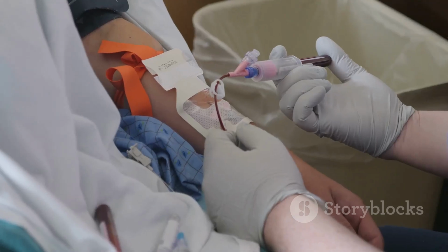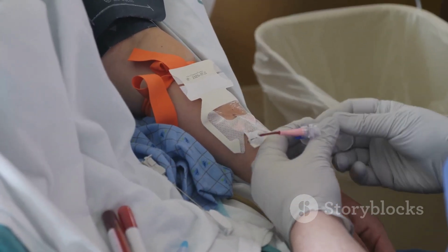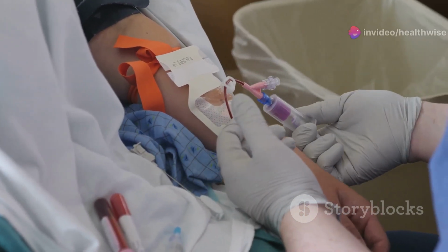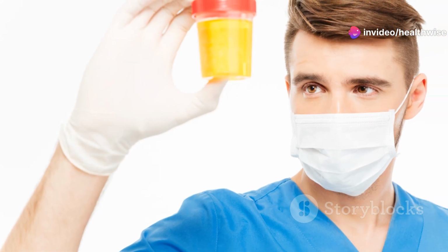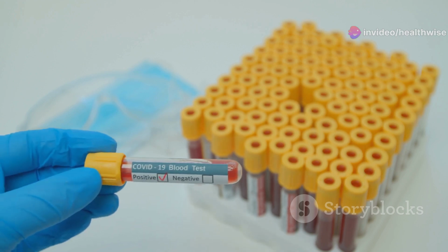For blood samples, a phlebotomist will typically use a tourniquet to locate a vein, clean the area with an antiseptic, and then draw the blood using a sterile needle. For urine samples, patients are given a sterile container and instructions on how to collect their sample properly.